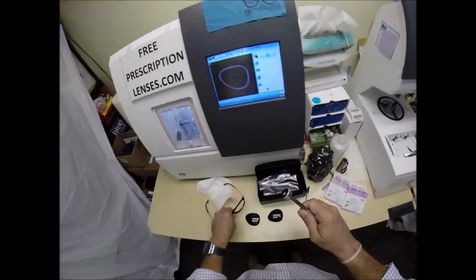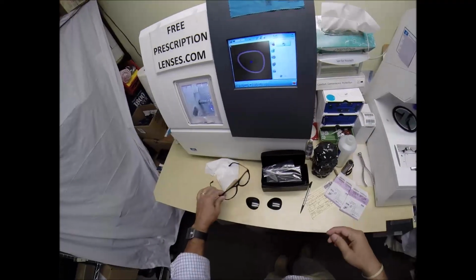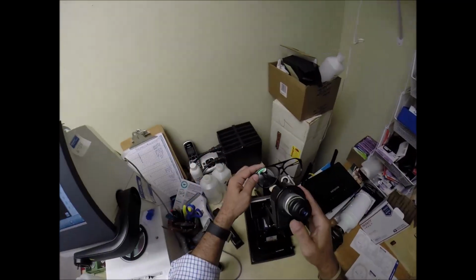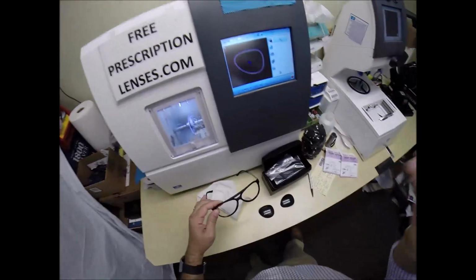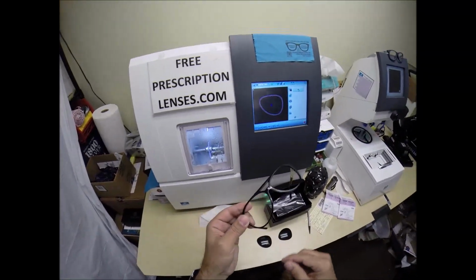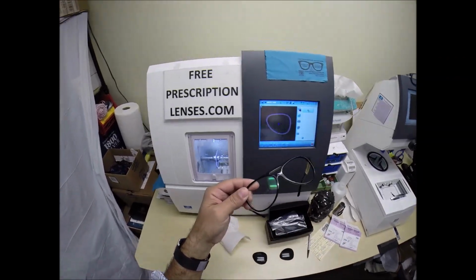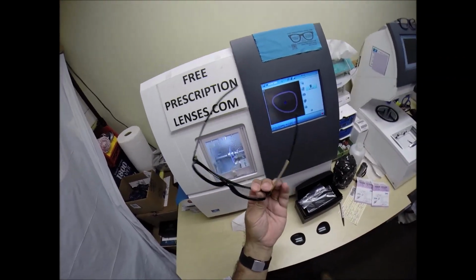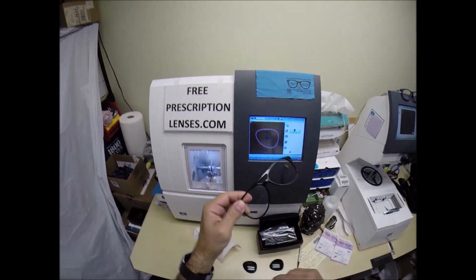So let's go ahead and take this block off, pull the sticker off, dry that off, stick that on top there. Now again, if these were prescription, I would come down here to my lensometer and verify, but I don't have to do that on these. Now your lenses are made, the reason why it's safe, these are polycarbonate lenses. The clear lenses I put in are polycarbonate. Polycarbonate, not only is it 40% thinner and lighter than regular plastic, it is also virtually unbreakable.